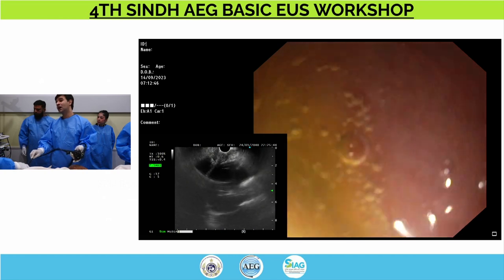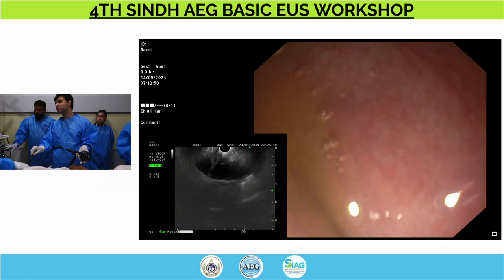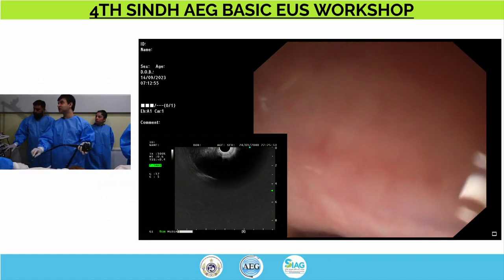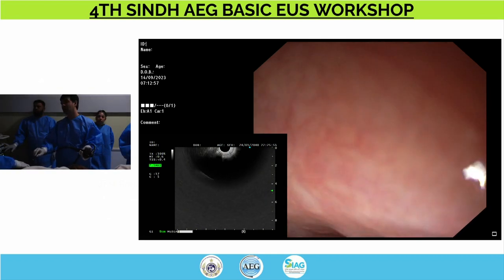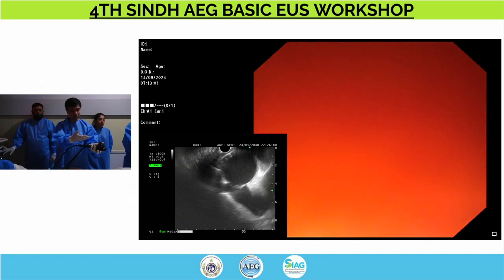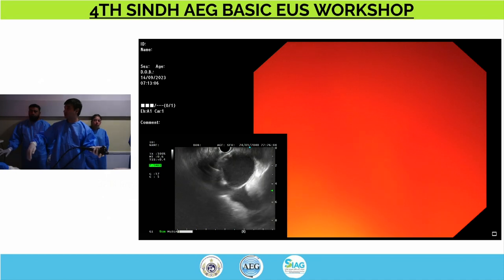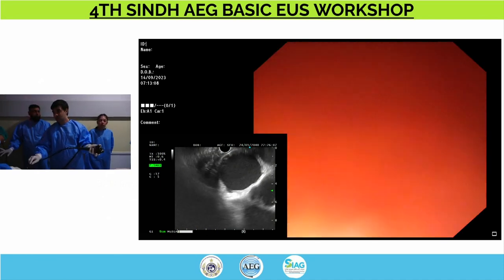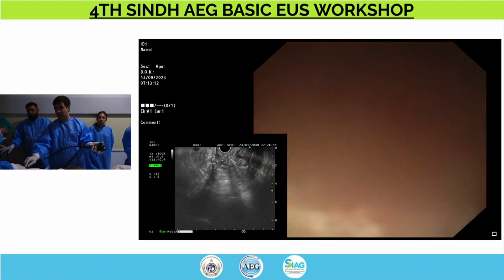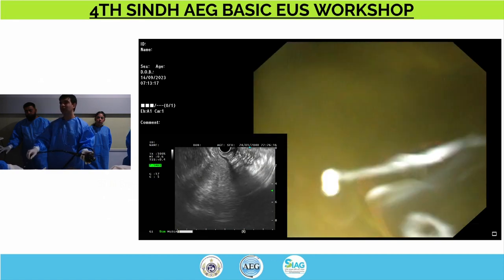And I'm now focusing solely on two things. I'm looking at the color of the mucosa here in the esophagus, and I'm focusing on how much resistance there is to passage of my scope. Like Dr. Hassan mentioned, you always want to be in a neutral position with your dials facing up, and there being an unrestricted curvature on the body of your scope. So we're slowly introducing our scope in, and I'm suctioning as we're doing that. And we see a stomach that's full of liquid.